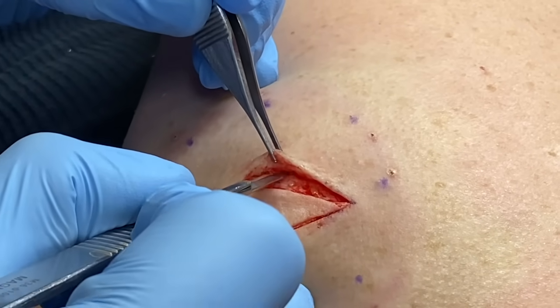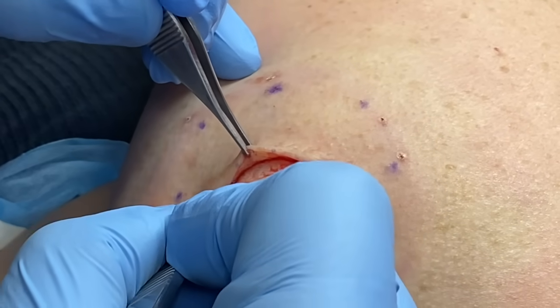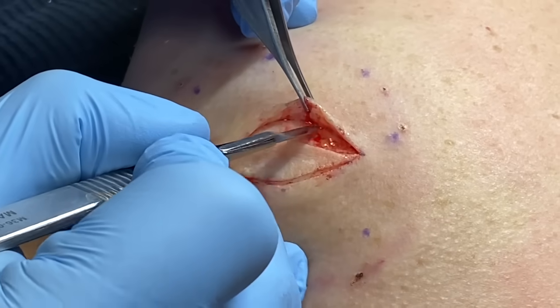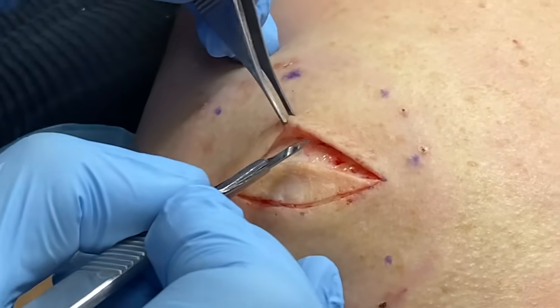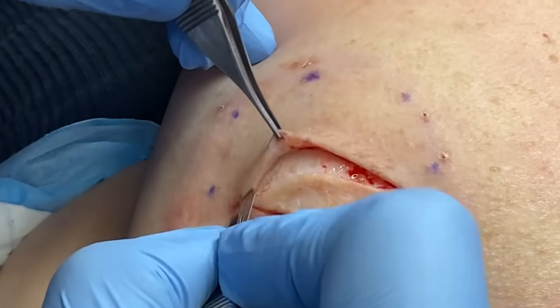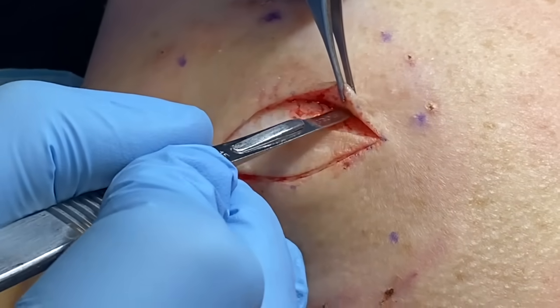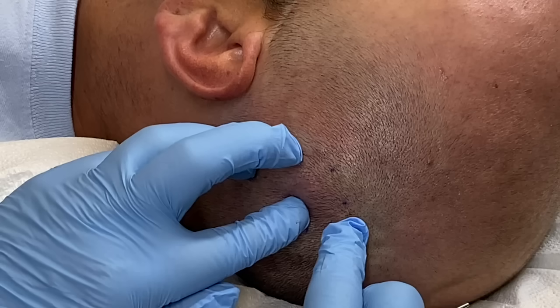And all that, it doesn't change much in terms of what you're going about. You just want to be dissecting down. I want to maintain the capsule as long as possible. And ideally, if I can take it out intact, and I don't do that from an ego perspective, it's done simply because if it's intact, then we know it's entirely out. So if it ruptures, it ruptures. But in this particular case, when you're dealing with medium to larger size ones, sometimes you actually need to rupture them just because getting it outside the incision becomes complicated. But I would tell you that's fewer and far between. Typically you can dissect it down, and the reality is it might just be more a function of taking more time.